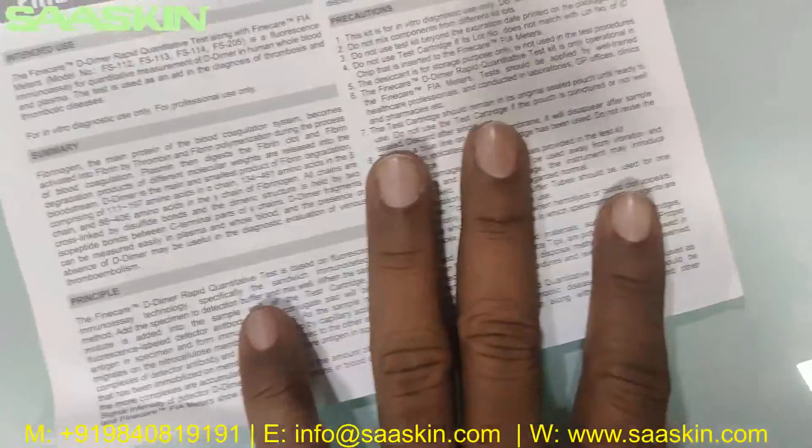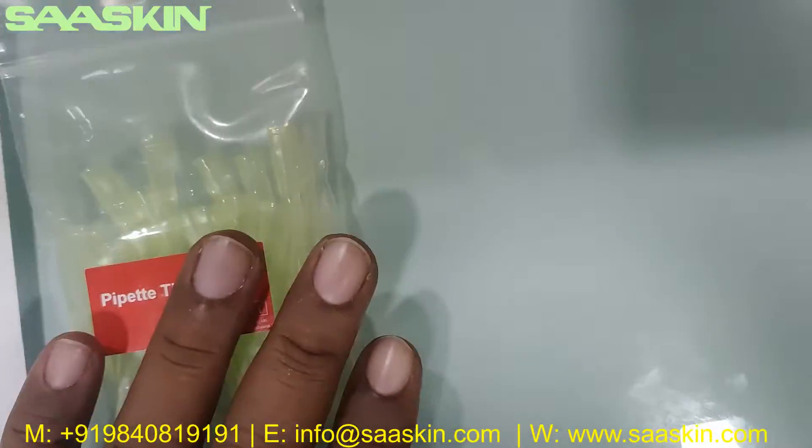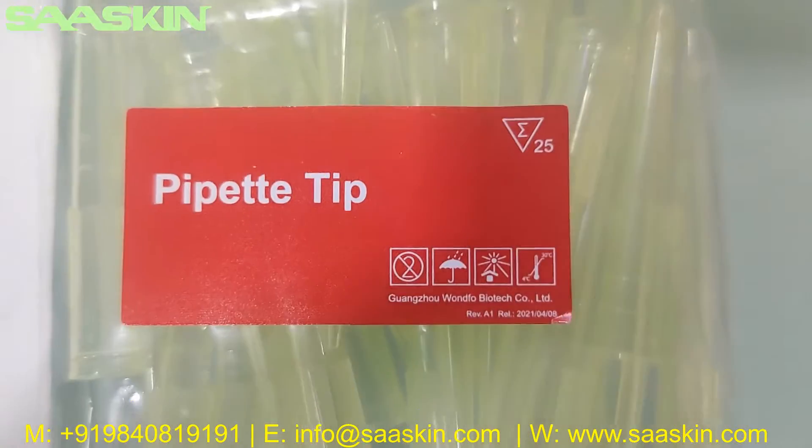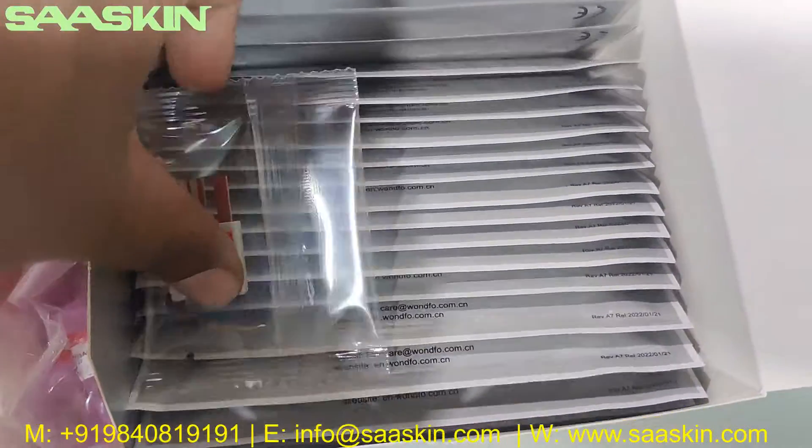How to interpret the results — you have the complete details here. Inside you can also see there are 25 pipette tips. There is one ID chip included in the kit.